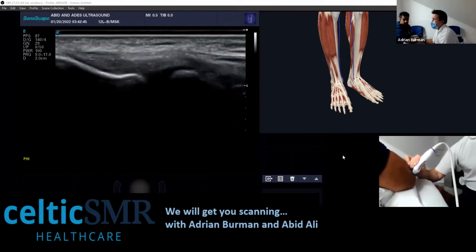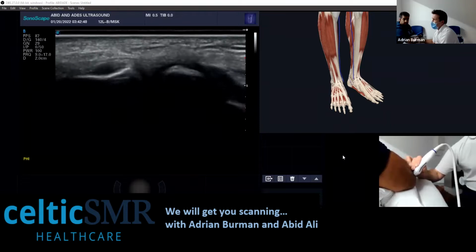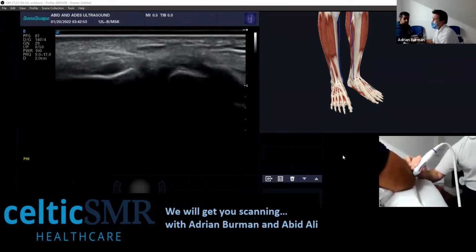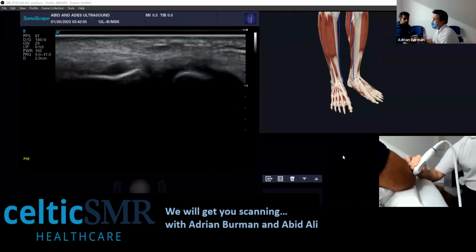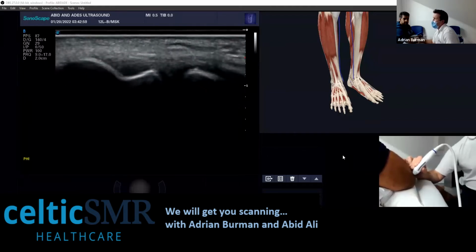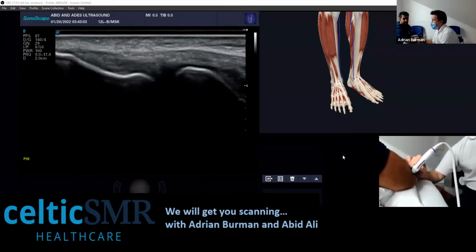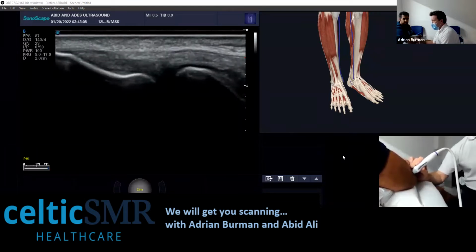And as you move down the elbow, you come to this structure here, which will be your lateral collateral ligaments. What features would you expect to see to help confirm your diagnosis? Are you going to get calipers out at this point at all? So if you saw a tear here, you just sort of measure the tear in a long section.